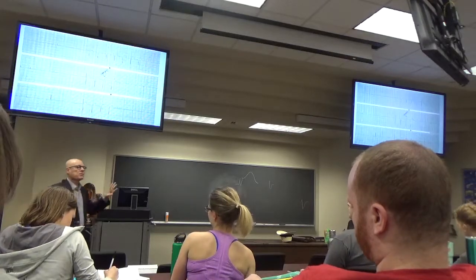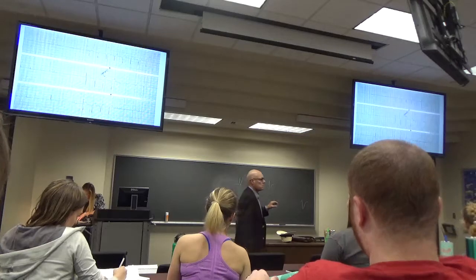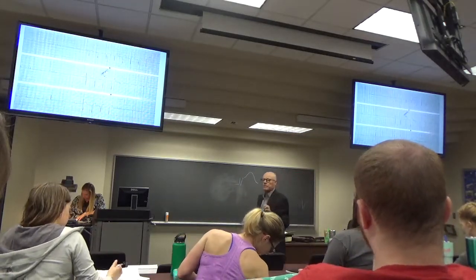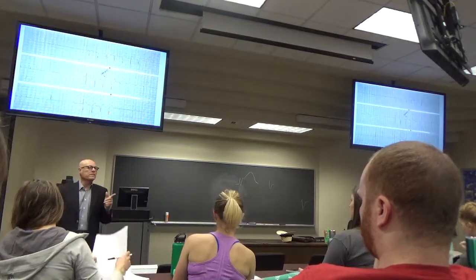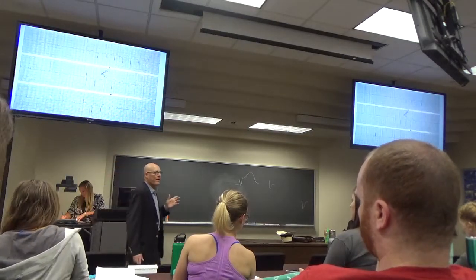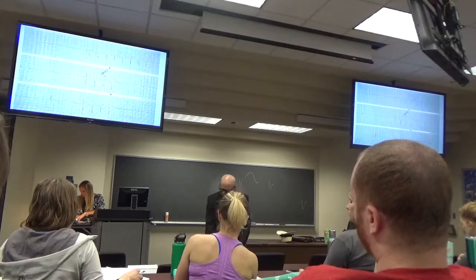You might miss some of the subtleties, but you'll pick up all the important ones. Is there an infarct? Where is it? What's the rhythm? Glancing at it, you'll be able to know whether it's a normal axis, right axis, or left axis. Just glancing at it, you're beginning to do that now. So you're well on your way.